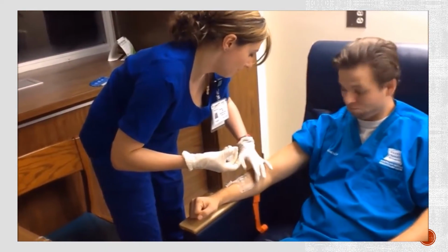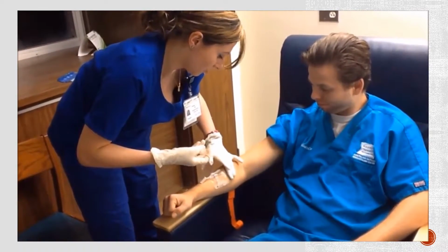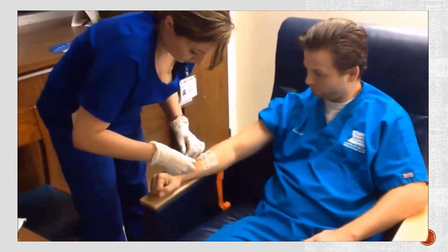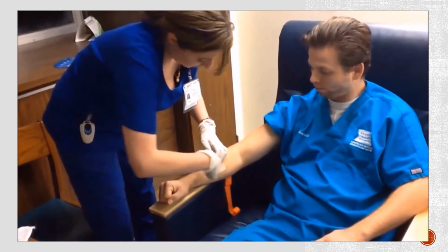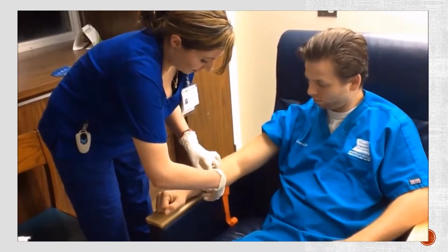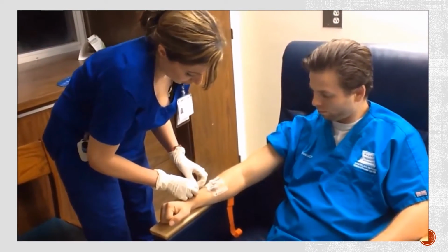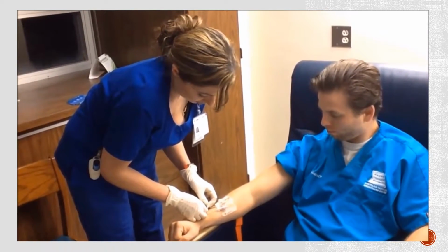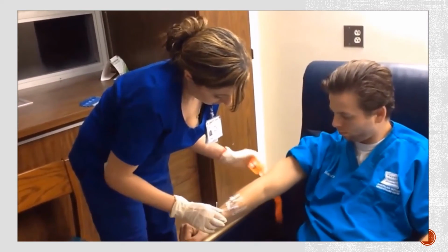I feel okay. Any pain? You're going to feel around after you have the infusion going to make sure that there's no redness or swelling. And then I secure this part with some tape to make sure that it doesn't pull on anything, because the extension tubing can get caught on different devices and lines. And you'll close it off as well with the clamp right here to make sure that air doesn't get in. It just kind of keeps the whole system a little bit more clean. And then you'll get rid of your tourniquet.